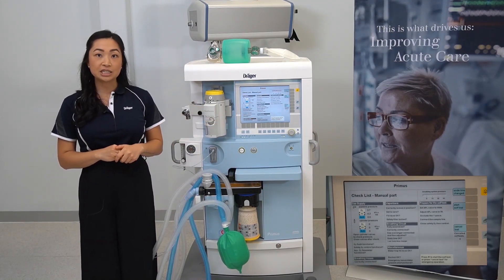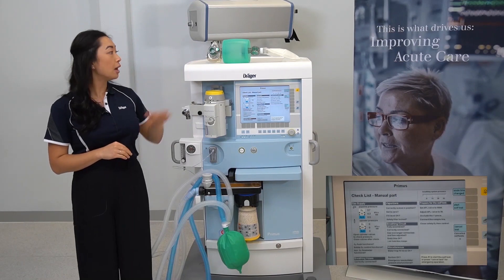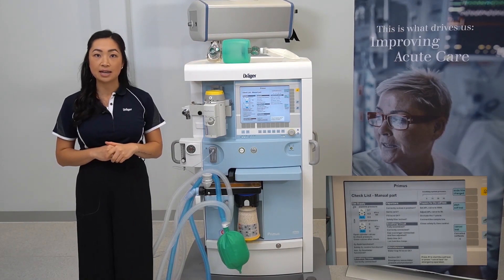Check your suctioning device is functioning as per your usual practice, and ensure a manual resuscitator is present in case of device malfunction.